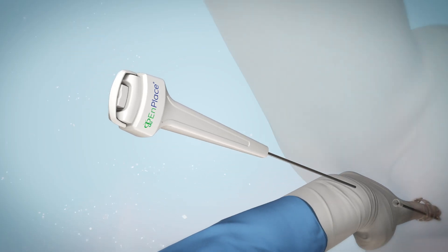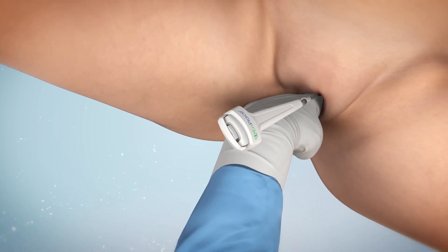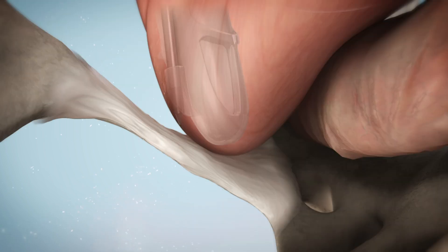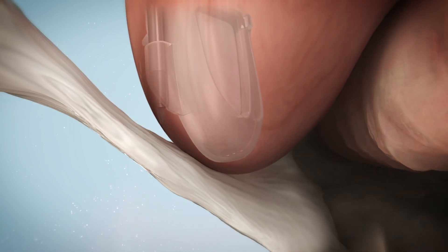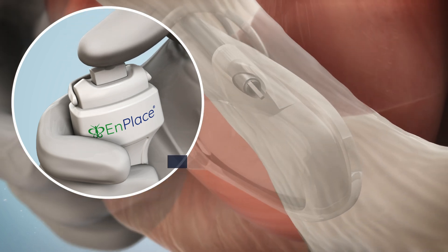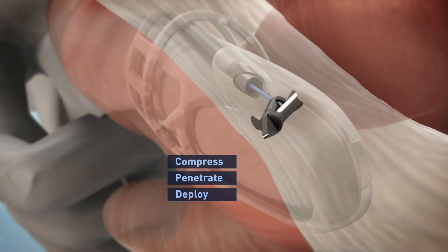Once you are familiar with the patient's anatomy, introduce the anchor inserter through the finger guide's working channel. Continue to apply pressure to flatten the vaginal mucosa, having swept the rectum away medially. The inserter should be introduced at an angle similar to the axis of the vagina — a rough guide is to maintain pressure at an approximate angle of about 45 degrees to the SSL.